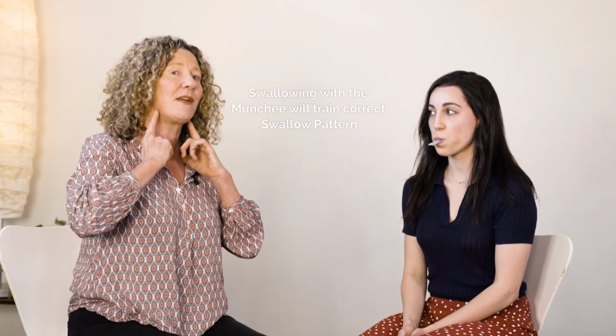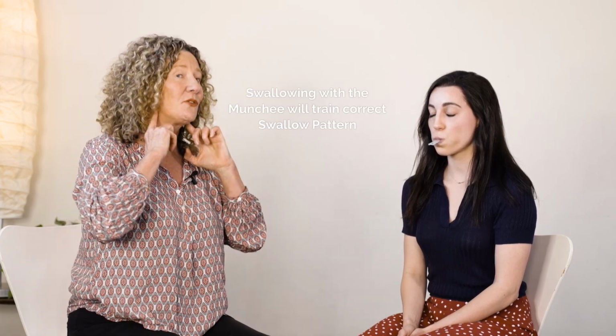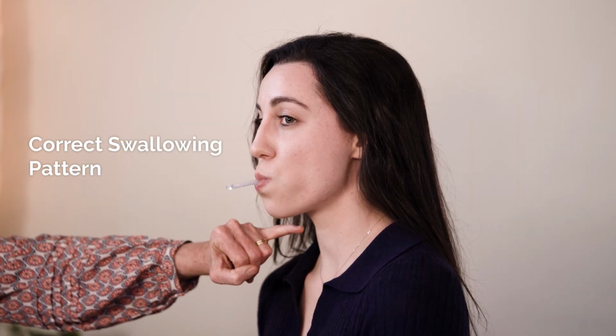And what that means is that she's going to be using the correct swallow pattern, which is the posterior aspect of the tongue and the muscles of the throat here. So she looks very comfortable with her chewing, which is great. Any chance of a swallow? There it goes. So did you see that down the back there? We saw this activation of these muscles down here, which is great.